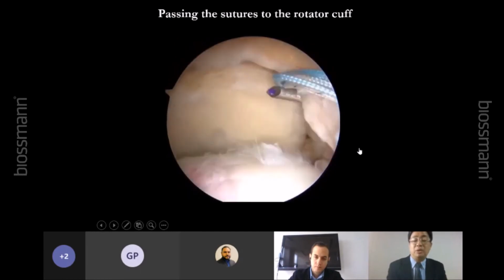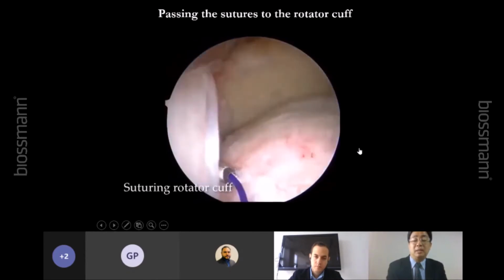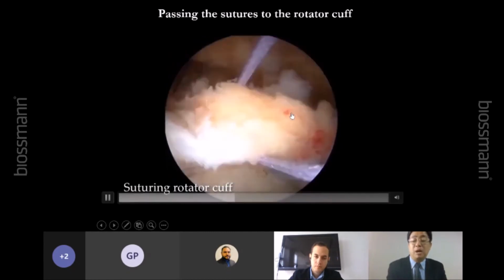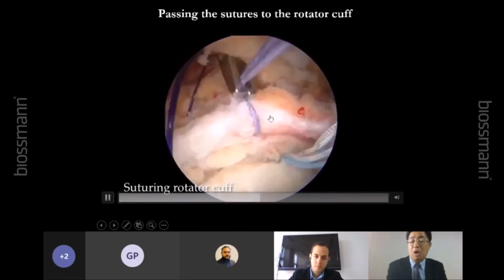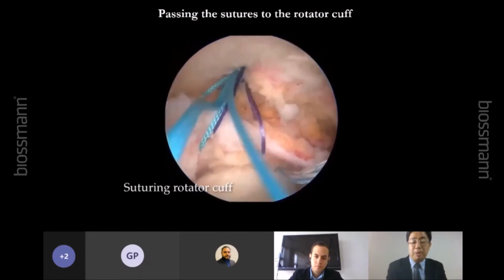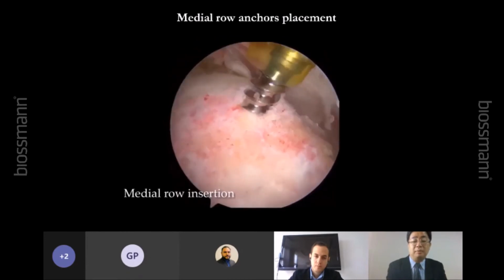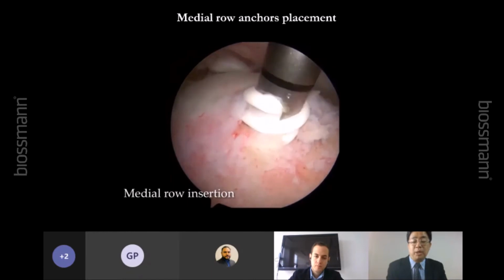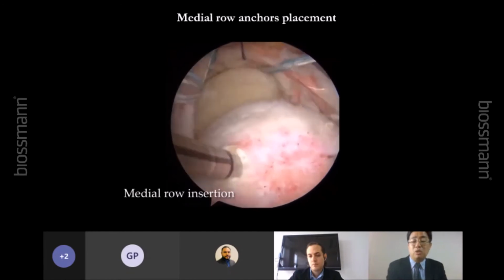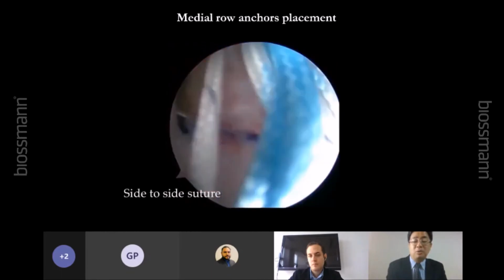And after that I use the side to side repair, 1 in the front, 1 in the back. After I repair, I put my rotator cuff over my graft like that also. So we do the bed preparation. After we're ready, we put the anchors at the footprint, 2 anchors at the footprint, triple load also. So that will be a total of 12 plus 12, 24 sutures. And make a side to side also.